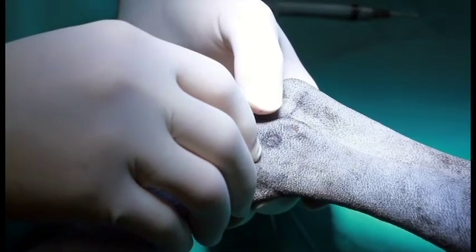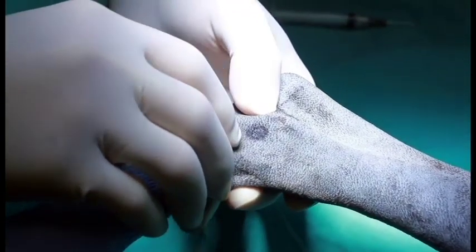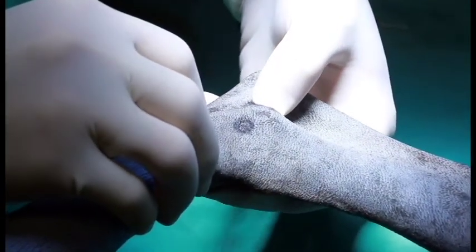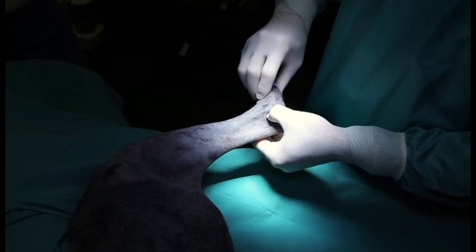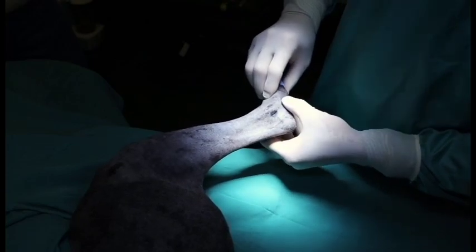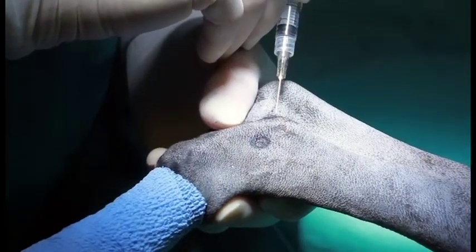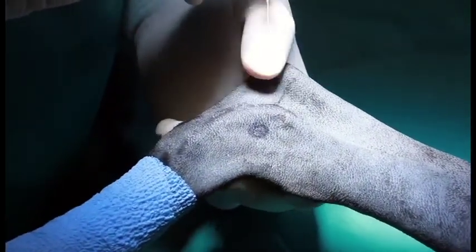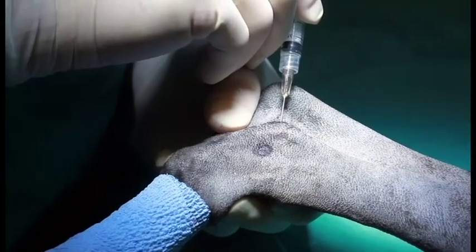To approach the hock joint we go laterally. There are two points of entrance: caudal and cranial. Your landmarks are the lateral malleolus of the fibula, the calcaneus, and if you press your thumb in you can feel the distal end of the tibia. By flexing and extending the joint there's a depression that you can feel with your thumb, and that's your port of entrance for your caudal injection site. We like to angle the needle cranially, distally, and medially. Feel your depression and go between the lateral malleolus and the distal end of the tibia into the joint.